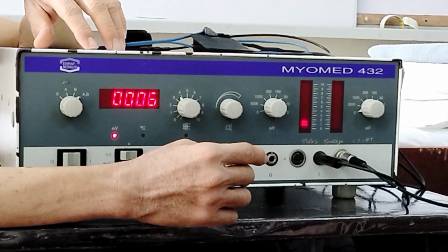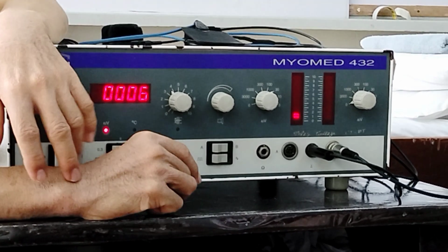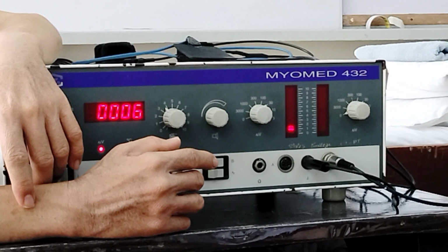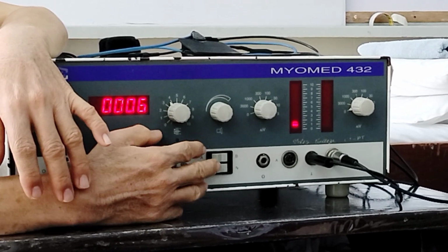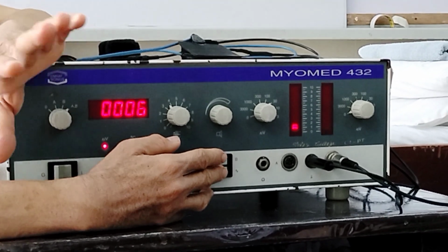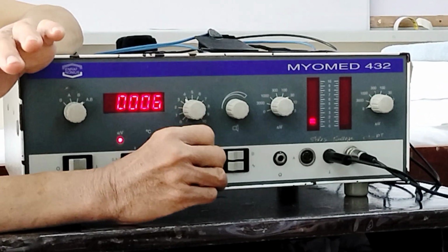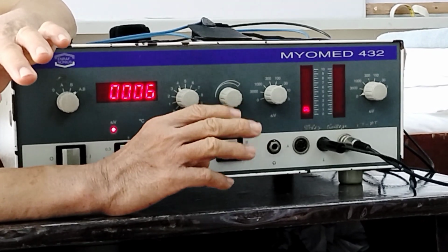One way of choosing the sound is to determine which sound the patient likes to hear, or which sound the patient doesn't like to hear. If you want to increase muscle action or contraction, you have to choose a sound the patient likes to hear. The tendency is that when a patient contracts, the sound becomes faster, louder, or stronger.